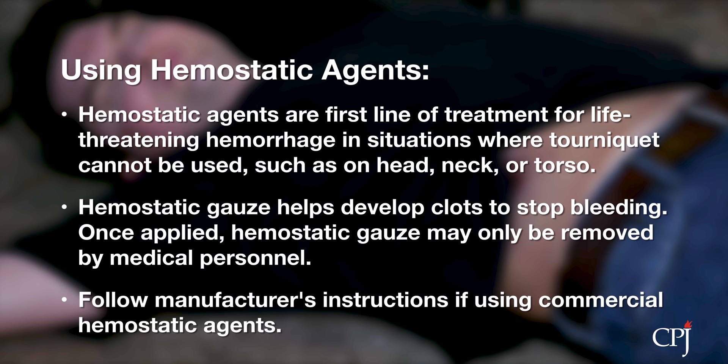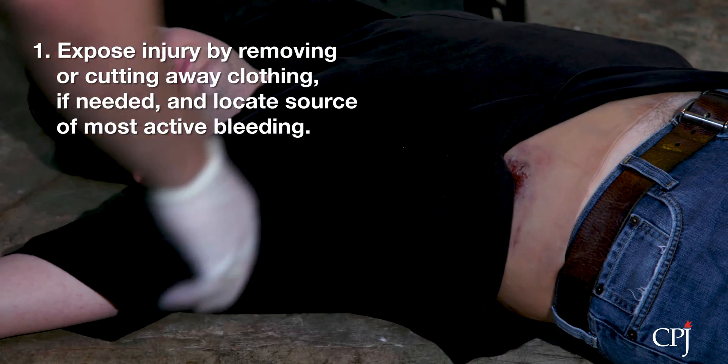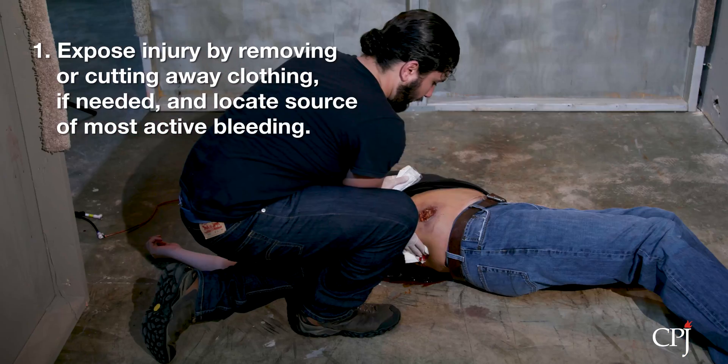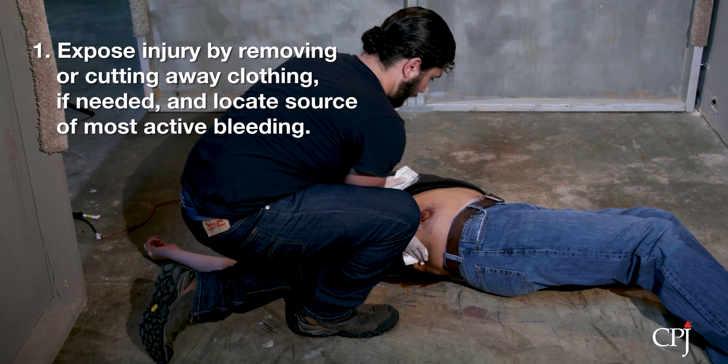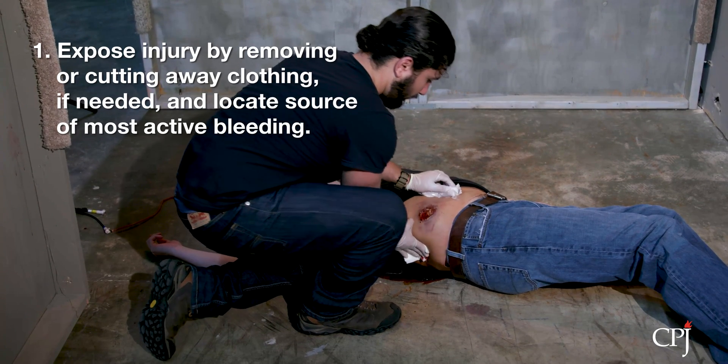If using a commercial hemostatic agent, follow the instructions provided by the manufacturer. To use hemostatic gauze, expose the injury by removing or cutting away clothing. Wipe excess blood from the wound while preserving any clots that may have formed if possible. Locate the source of the most active bleeding.